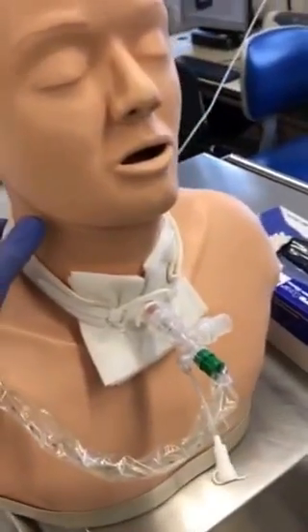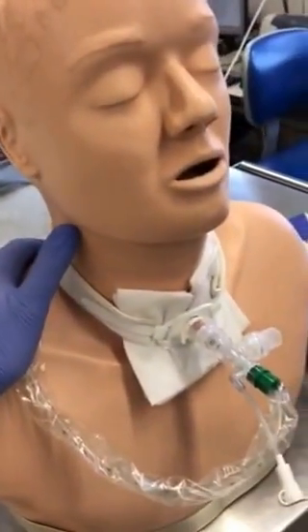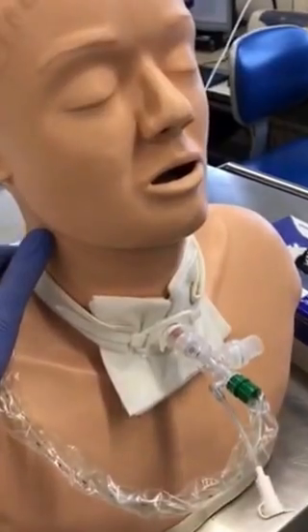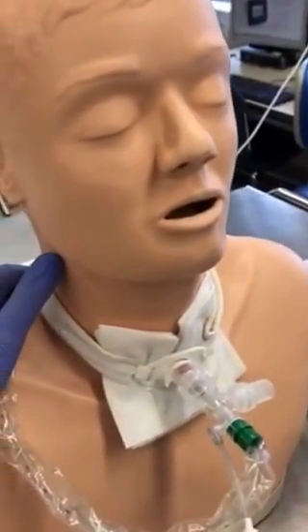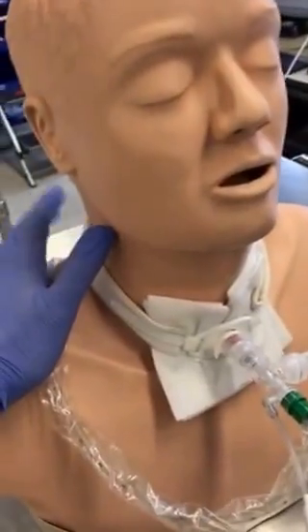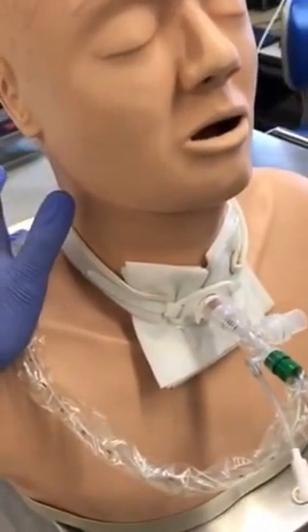Like I said, our patient is ASIA A, so that means he has a complete lack of motor and sensory function below the level of injury, including the anal area. Whereas grade B, which my patient won't have, has some sensation below the level of injury, including anal sensation. So what I'm going to show you today is how to use this cough assist machine.